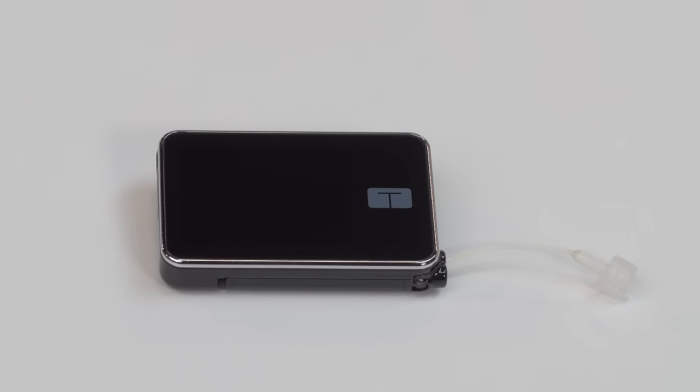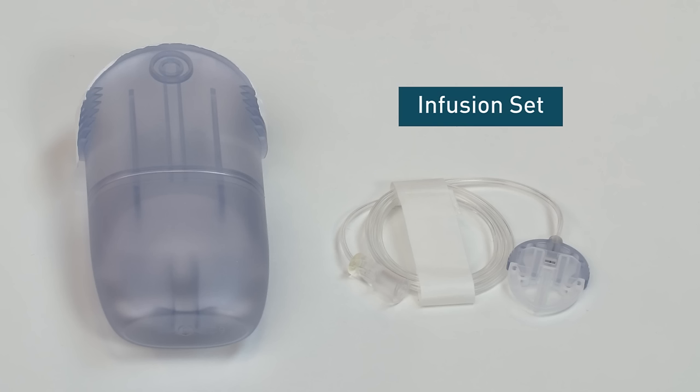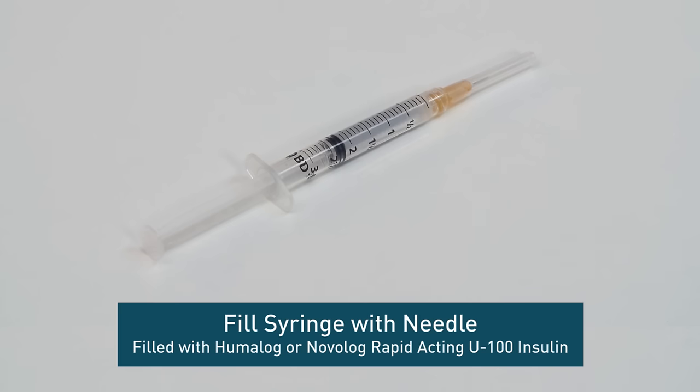In this video, we will be using the following items: a new unused cartridge, a new unused infusion set, a cartridge removal tool or coin, and a fill syringe with needle filled with either Humalog or Novolog Rapid Acting U100 insulin.